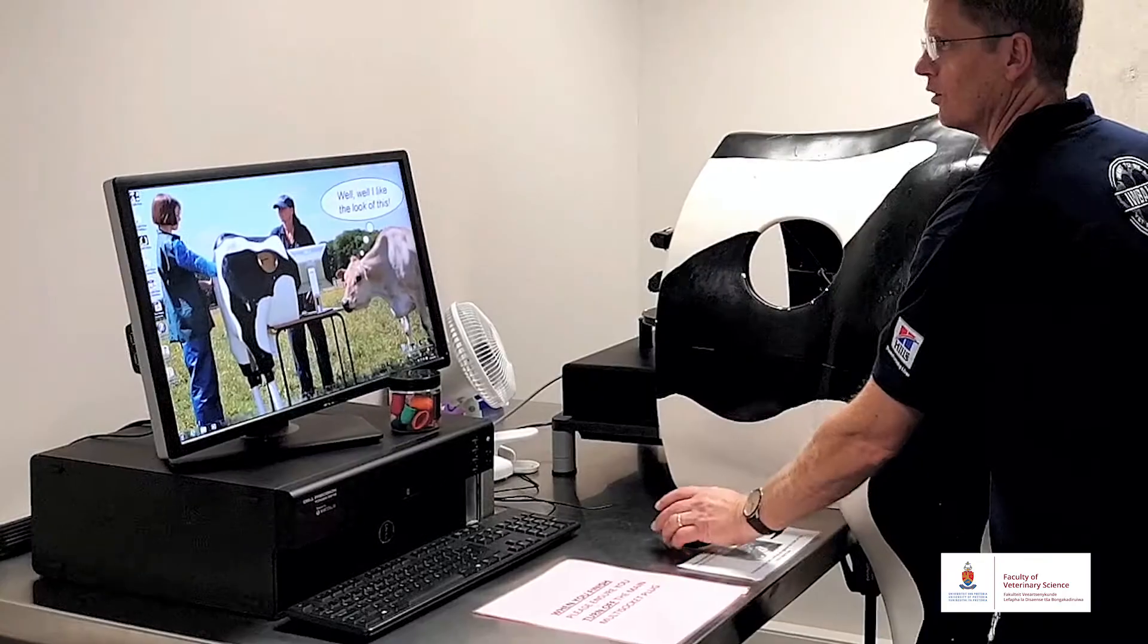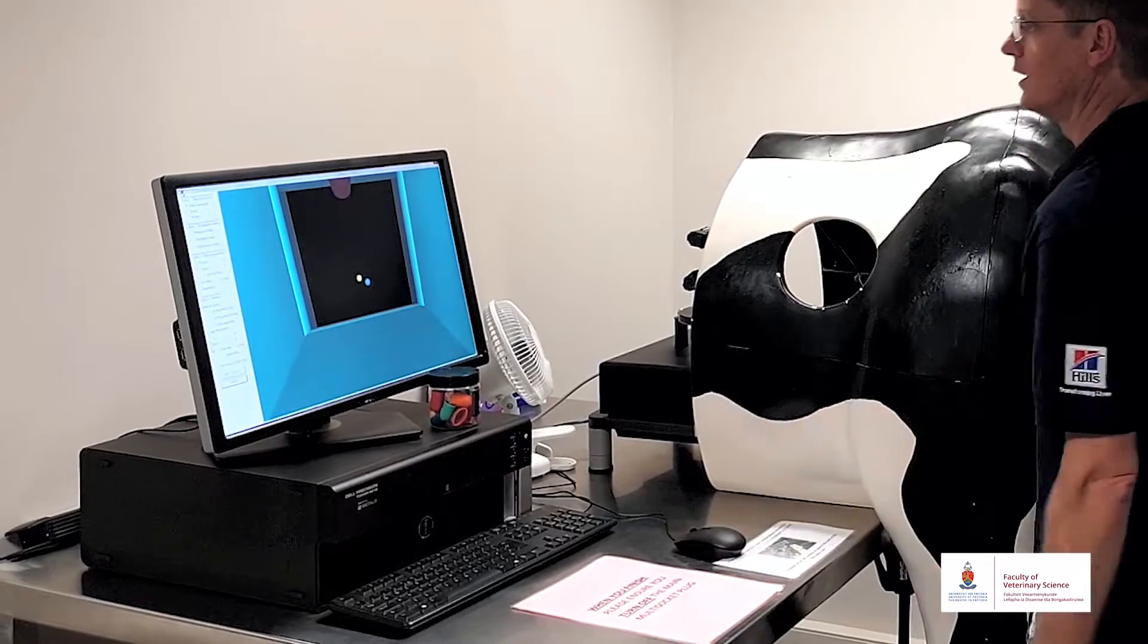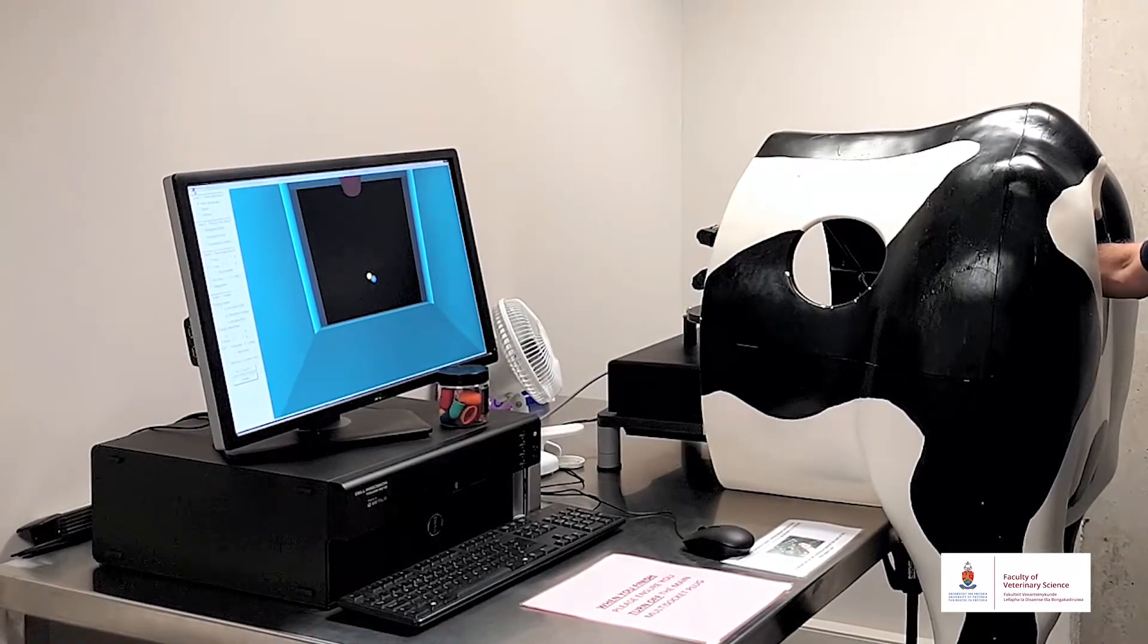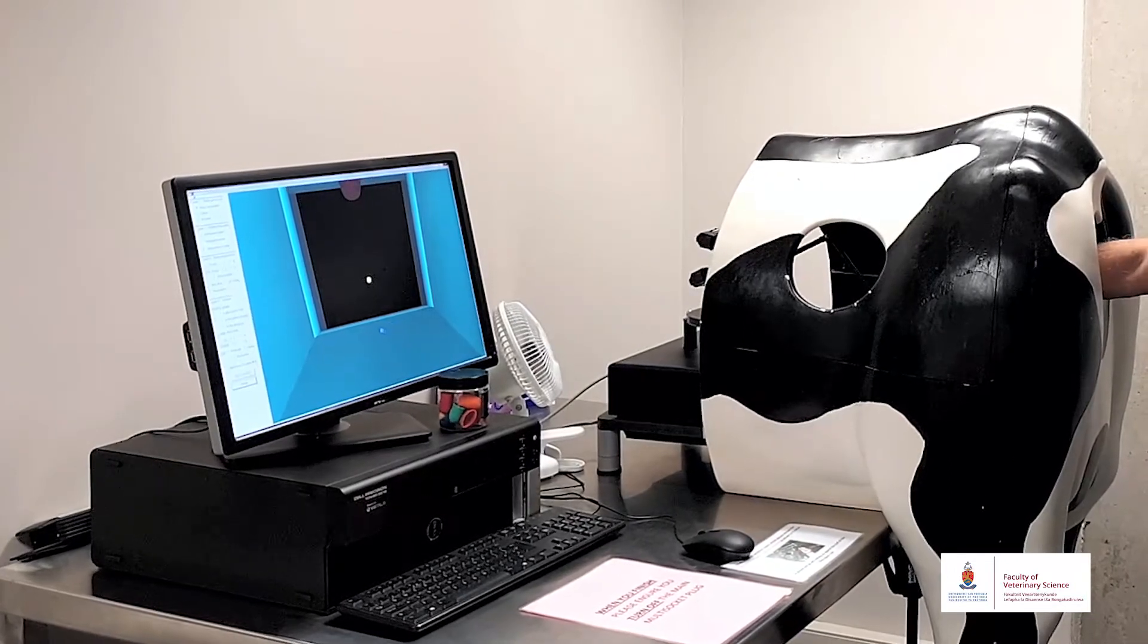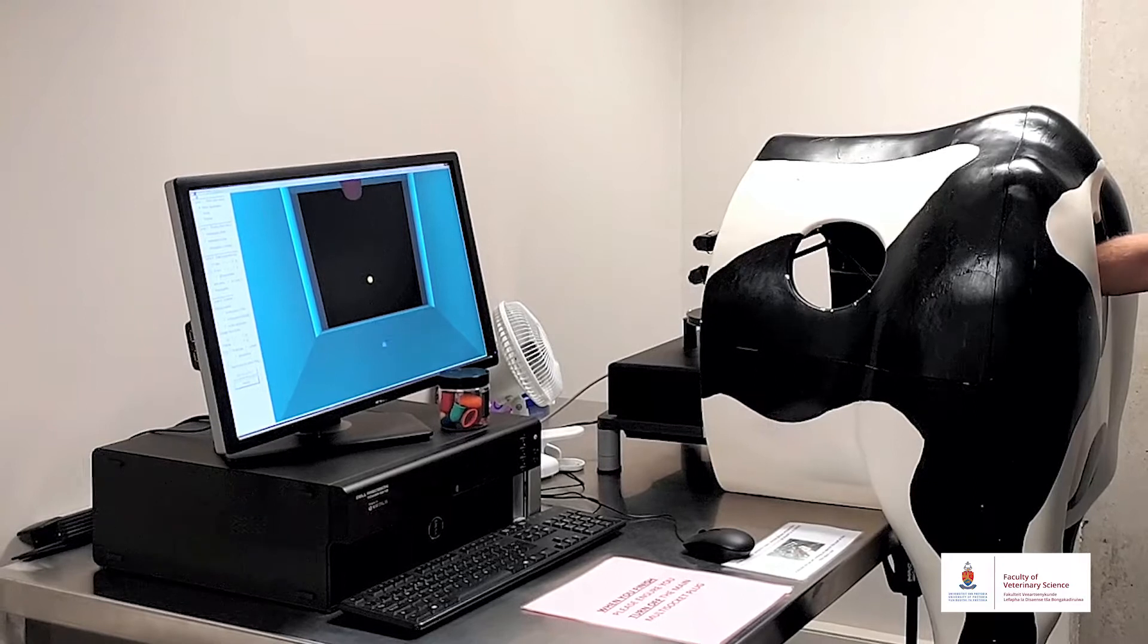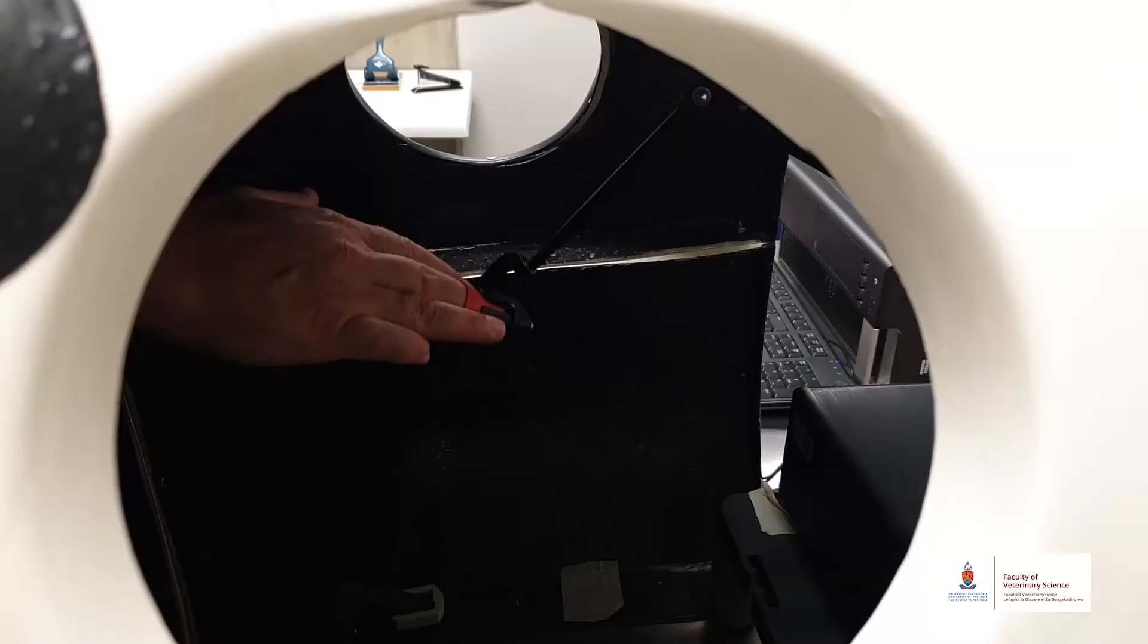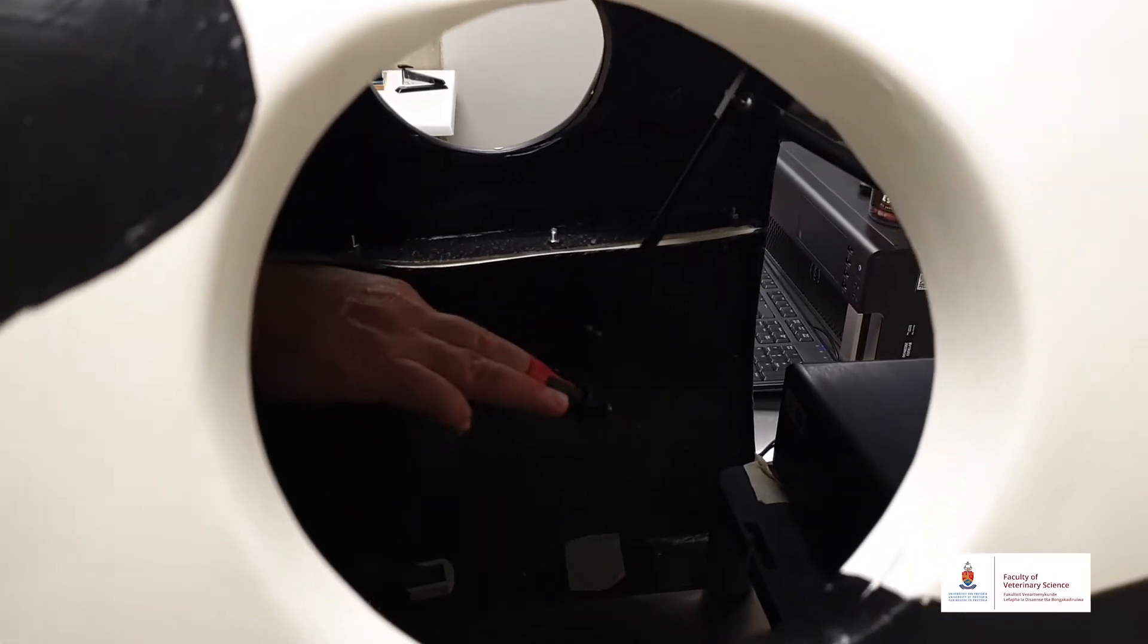On the computer I've got different settings and different options. Let's start with the haptic cow. The first thing that I'm going to do, as you can see on the screen, is that the computer will teach me where to find the edges of the pelvis in a cow. And there my finger goes over the brim of the pelvis into the abdomen.